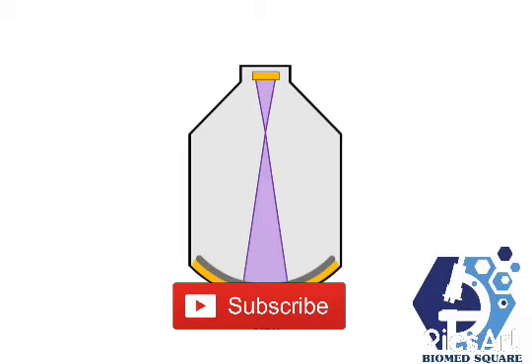Luckily, many modern-day fluoro machines use automatic exposure systems and automatic brightness controls. It is always best practice to be aware of your technique and how long the patient is being exposed.